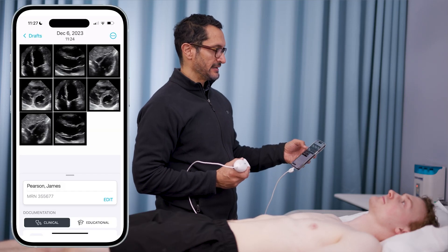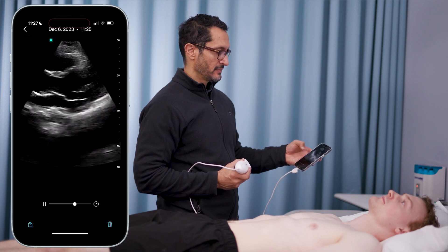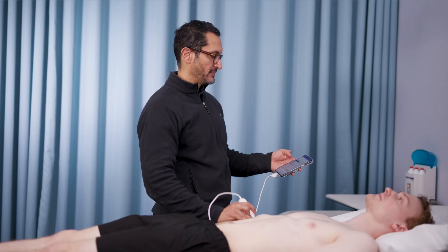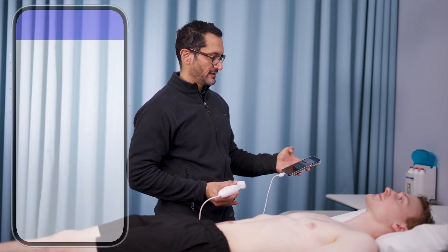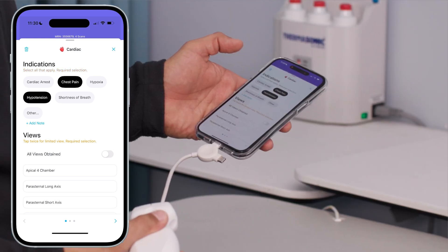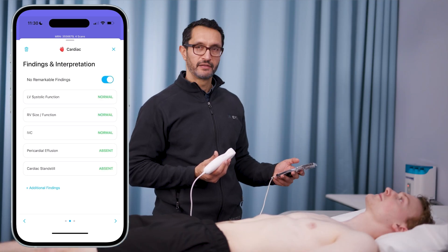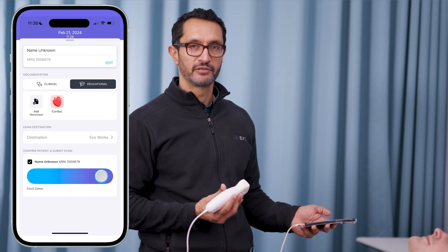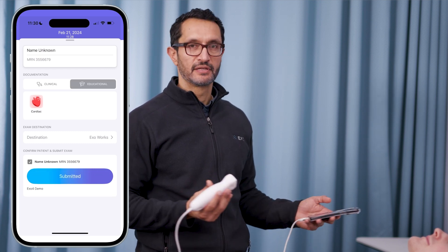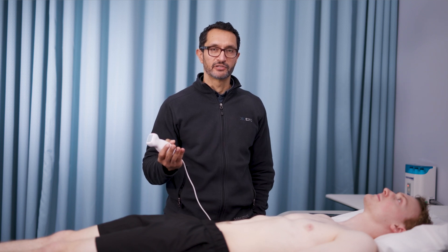Once I finish scanning, I can easily look at my entire gallery of images and videos and scroll through them in real time. Documentation now happens very rapidly and simply — click what exam you did. I did an echo, I did it for chest pain and hypotension, parasternal long and apical four. The beauty of this is it can send the data directly in a DICOM format to your PAC server, directly to your electronic health record, or to the Echoworks cloud — it's really up to you. With Echoworks, you can QA all these exams, give rapid feedback, and help get your clinicians credentialed.